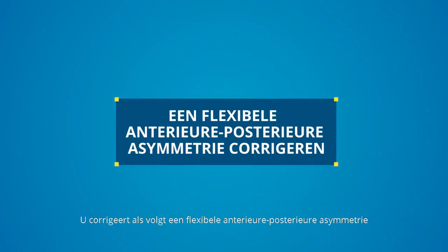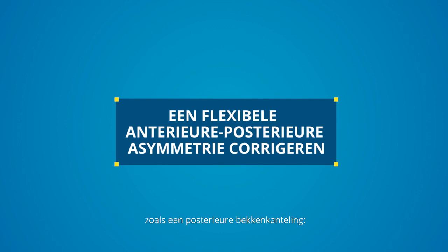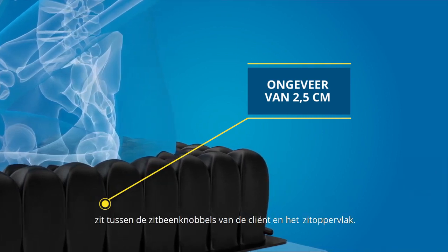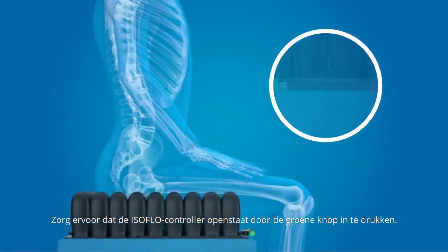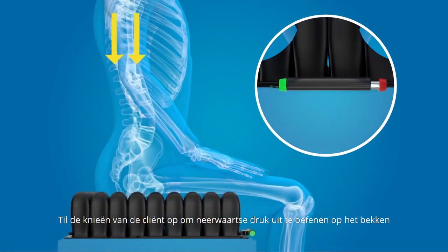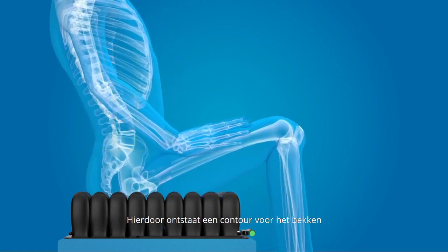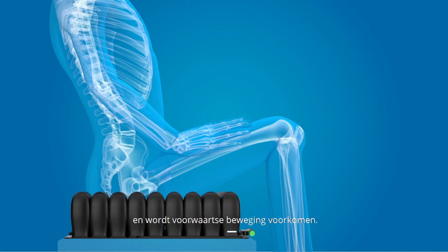To correct a flexible anterior-posterior asymmetry like a posterior pelvic tilt, make sure there is approximately one inch of air between the client's ischial tuberosities and the seat surface. Make sure the isoflow control is open by pressing the green knob in. Lift the client's knees to put downward pressure on the pelvis and force air to the front quadrants. This creates a contour for the pelvis to prevent forward migration.